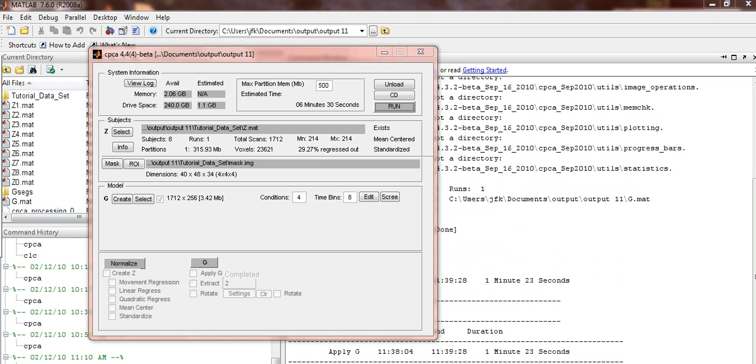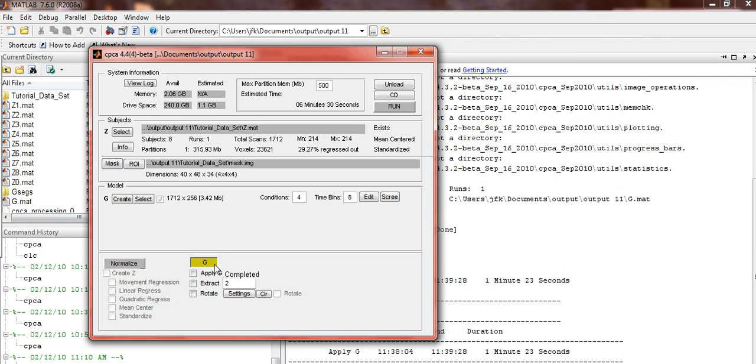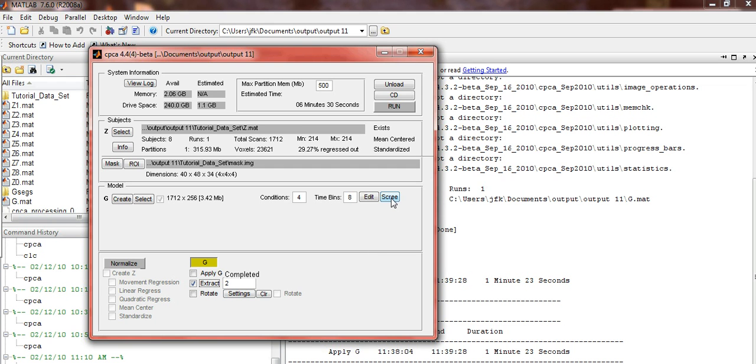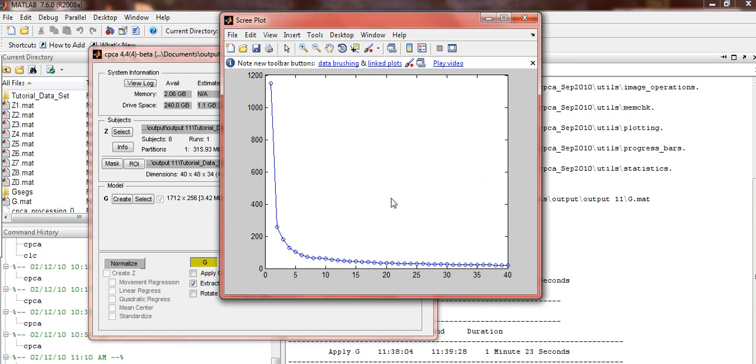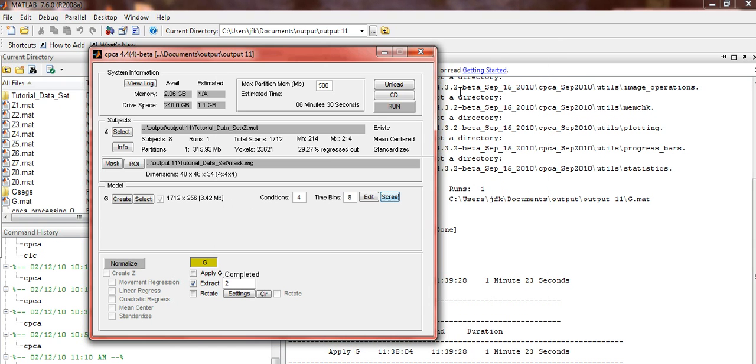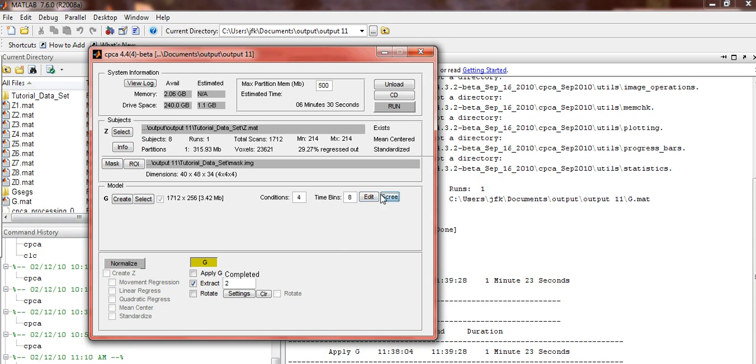Click on G on the processing panel to activate your options. Click the box beside Extract. For simplicity reasons, in this tutorial, we will just be extracting two components. To determine the number of components to extract in a normal CPCA process, click on the Scree button, and you will see a scree plot. Once again, for simplicity reasons, we will just be extracting two this time. Once again, click on Run.